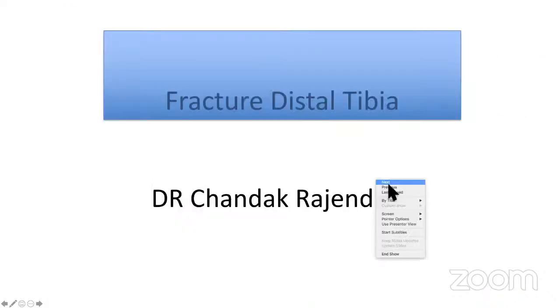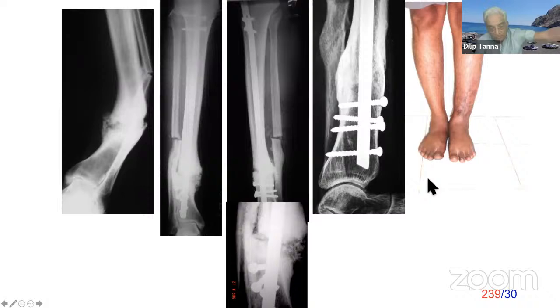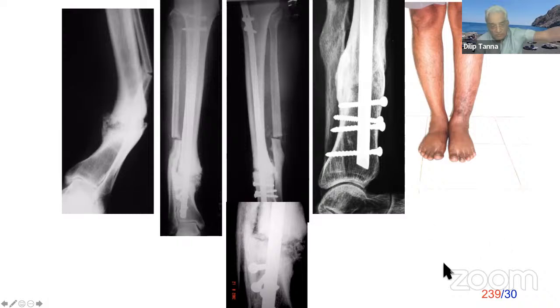Sir, in these cases, from where do you approach the fracture line? Sorry? What is the incision site for opening the fracture, either medially or laterally? For the tibia it will be anterior, and the fibula will be a separate incision. Okay.